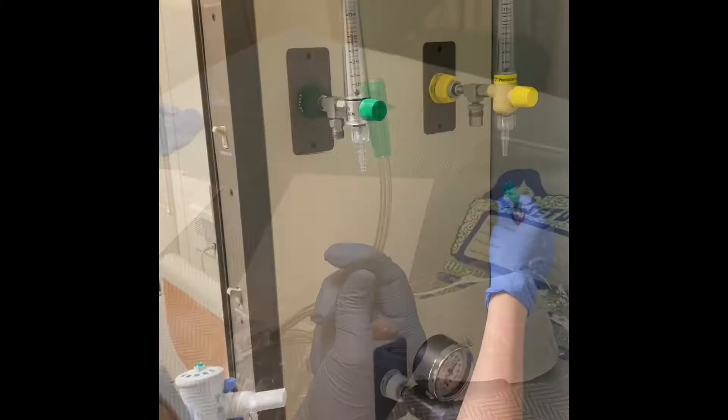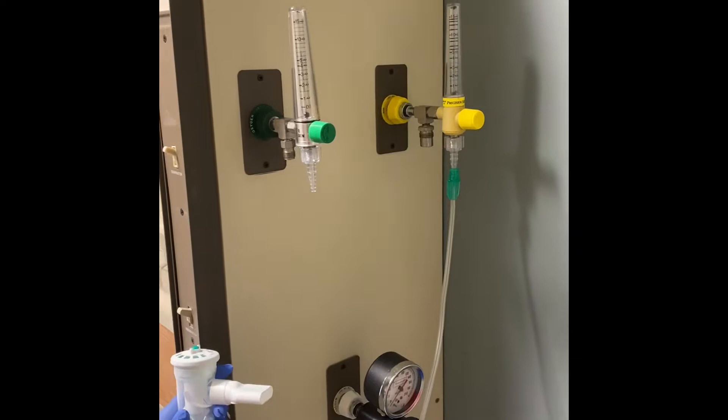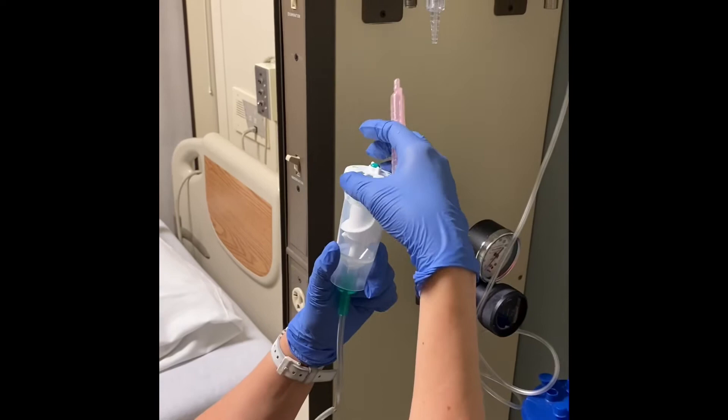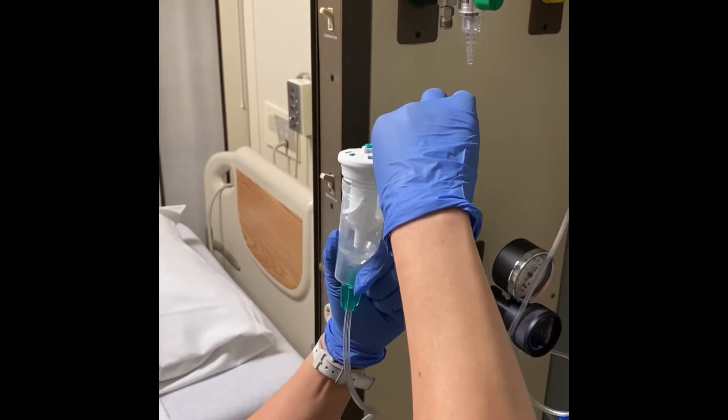For our elderly population and those with COPD, air is the preferred delivery gas, not oxygen. Some medications come in a concentrated form, such as 2.5 milligrams albuterol — make sure in this case you dilute it with 3 mLs normal saline in the pink bullet. For dual neb packages, no dilution is required.